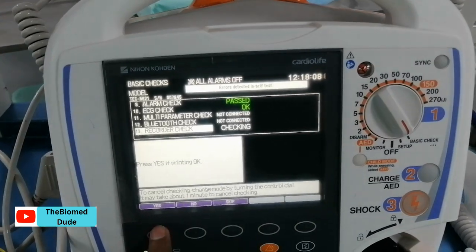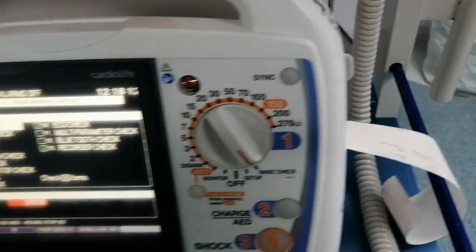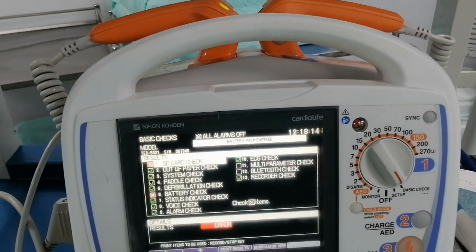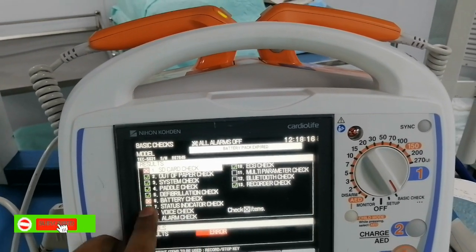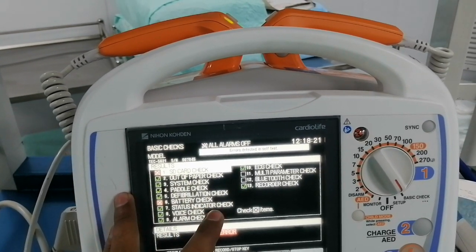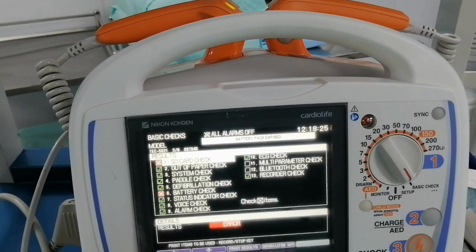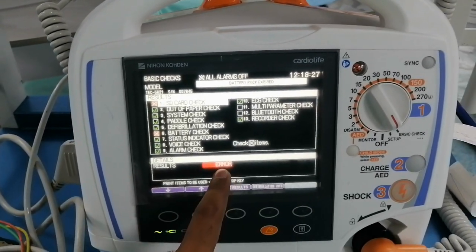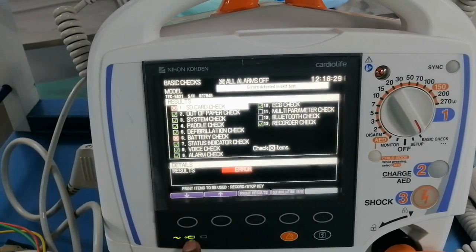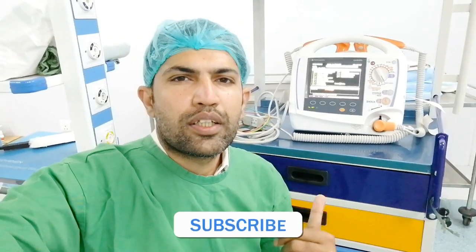Next is the recording check — I press this and the paper comes out. So here is the complete procedure to check the defibrillator. Two indications show errors: the SD card and the battery check. The battery most probably needs to be replaced after one year, but in this case the reason for the error is that the battery is empty, so I need to charge this defibrillator and check again. So guys, this is the basic check of the Nihon Kohden TEC-5621 defibrillator.